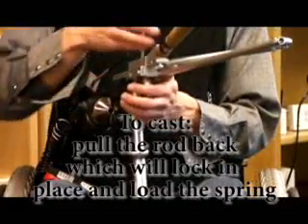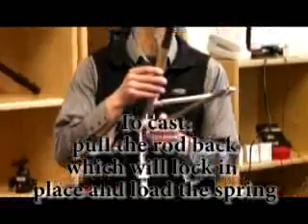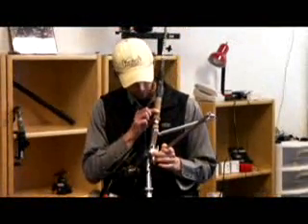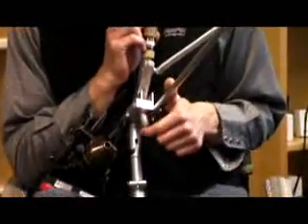To cast this rod, the user just pulls back on the rod, which tightens or clamps down on this wing nut.